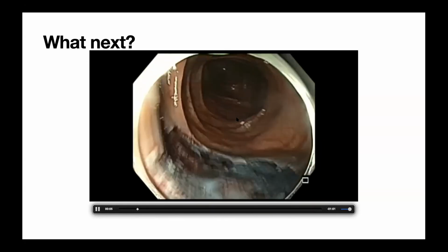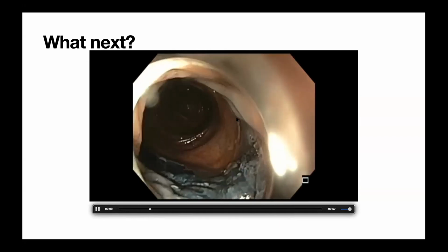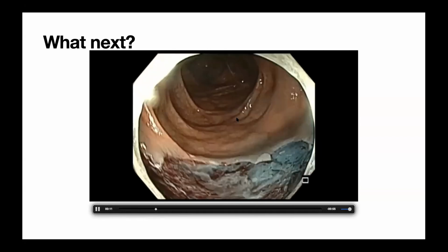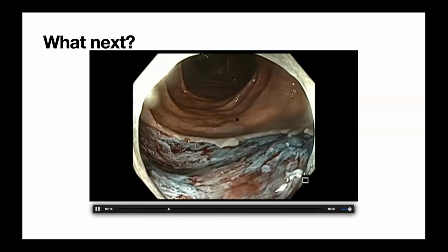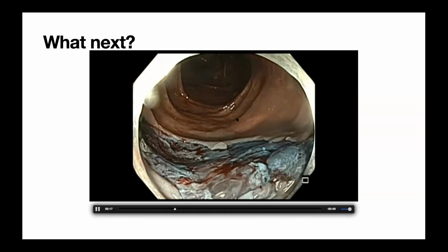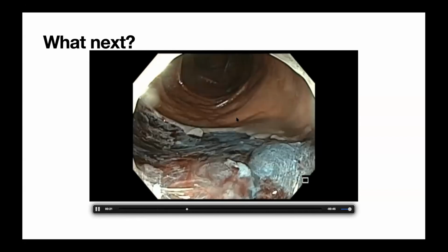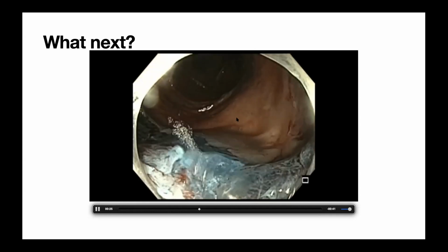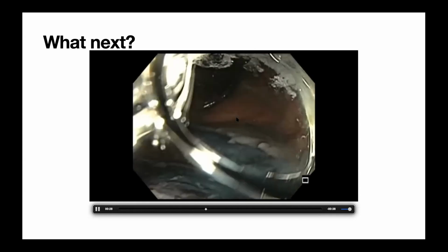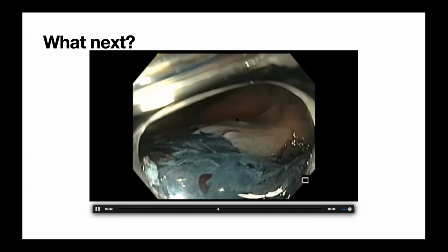So this is almost towards the end. Basically, what we did was, I want to share with you. We thought that we were done. I think we started around 5:30. We were cutting till about 7:30, and then at the end of the procedure, when I think I'm done, I usually go around the edge, millimeter by millimeter, to document that I have achieved complete resection.